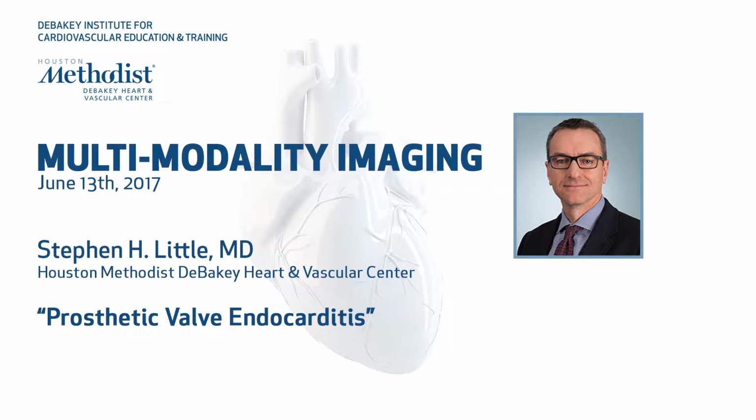So my task is prosthetic valve, or no, actually just endocarditis, CT, MRI, echo. I'll cut to the chase. It's all echo. There's no role for MRI. CT is very small. And I've given that talk, I think I've been here now 10 years, and I've given it about 1,000 times. So we're going to change gears a little bit.